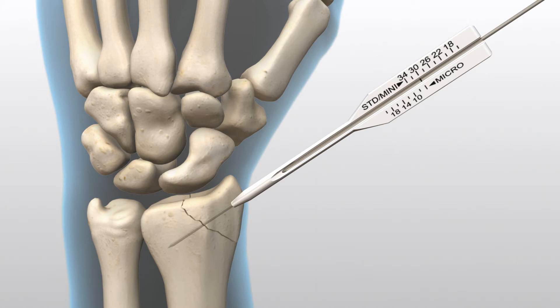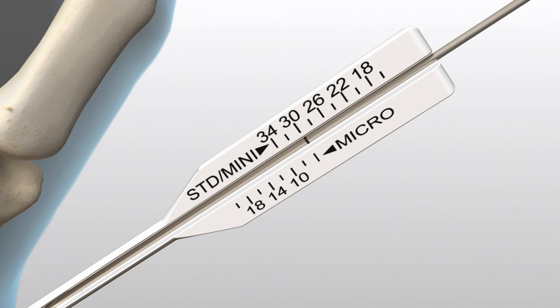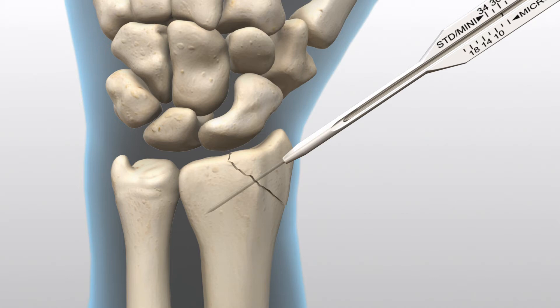Measure the wire depth with the side marked Standard and Mini on the percutaneous screw sizer. This measurement will determine the correct length of screw to be used. If the guide wire is within 2 millimeters of the far cortex, select a screw that is 2 millimeters shorter than the guide wire depth.